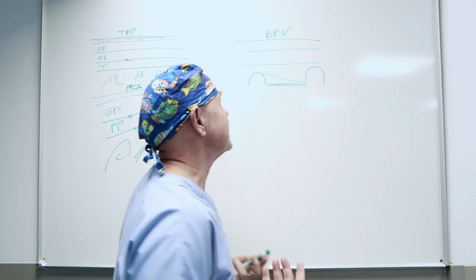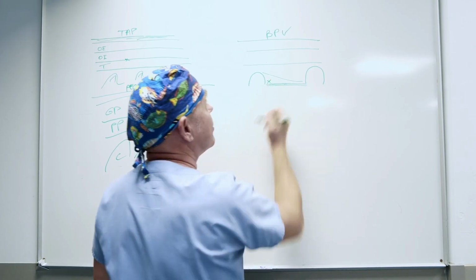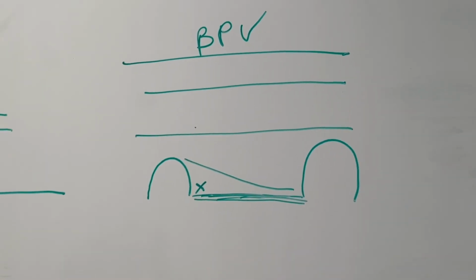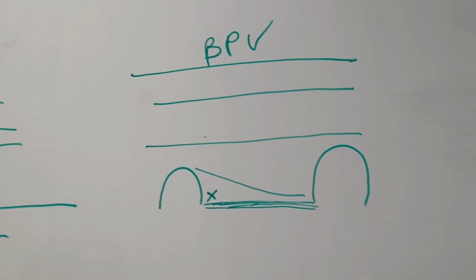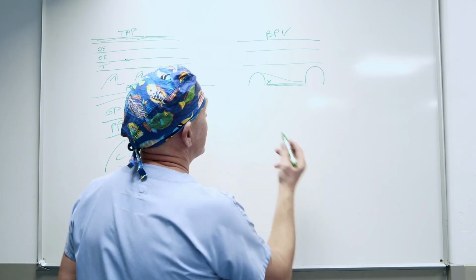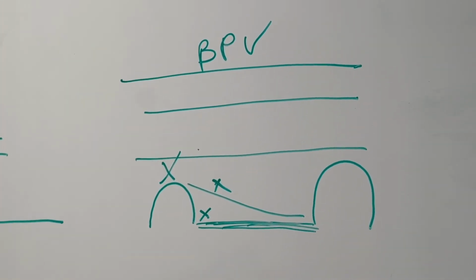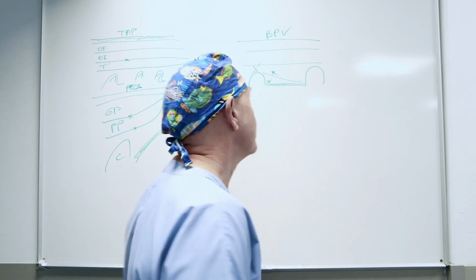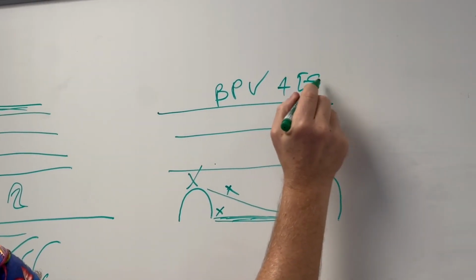But really, what is crucial is that in a paravertebral block, your specific site, your precise target, is located here. Therefore, we can deconstruct it as follows. This is the sonoanatomy. Here are the interspinal muscles. Here is the ligament. And these are the transverse processes. These are approximately the same anatomical landmarks as the erector spinae blocks, except that the target will make contact with the bone here, and then the needle will be positioned here. A singular, all-encompassing description that includes 3 distinct types of blocks. It remains consistently unchanged, so you have the erector spinae, and more specifically, the erector spinae block.